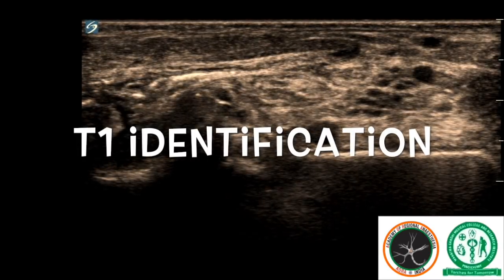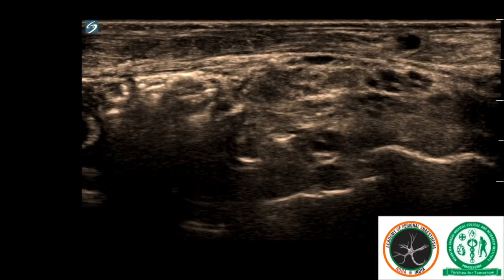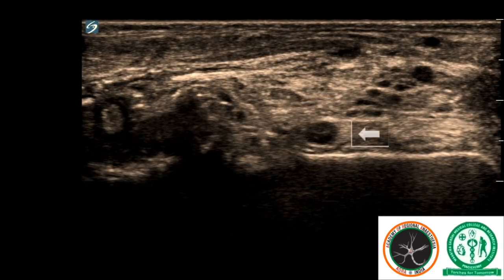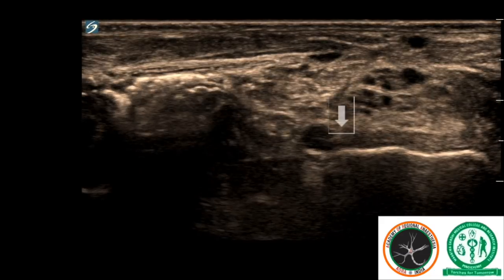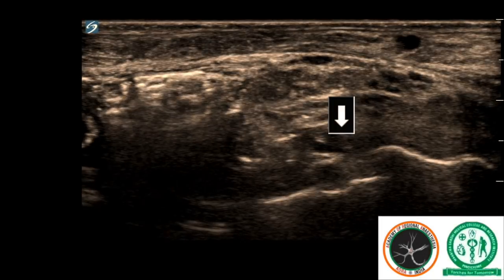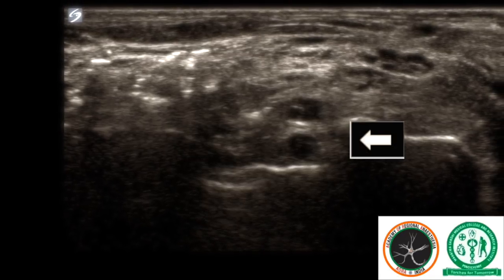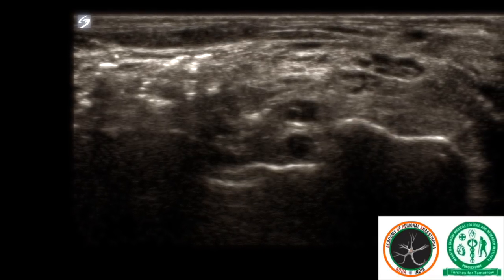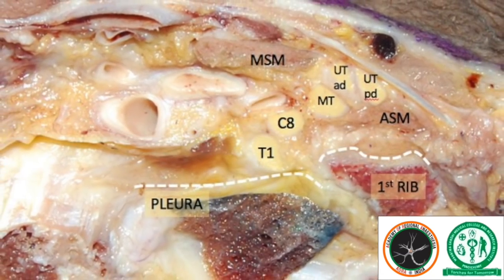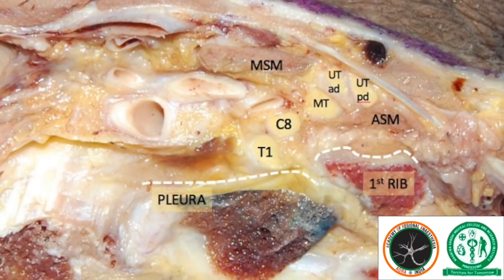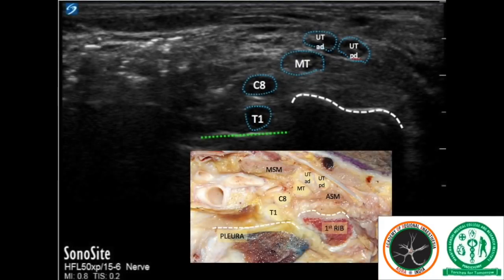Identification at the T1 proved to be a little trickier. After identification of the C8 above the first rib, which appeared as a continuous hyperechoic line, further scanning distally revealed a break in this line. After this break, we noticed a single, round, hypoechoic structure which appears below the first rib. This we assumed to be the T1 root. The actual anatomy confirmed our assumptions, revealing that the T1 root was below the rib and above the pleura.